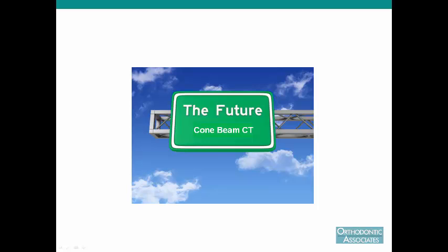So do I think cone beam CT is part of the future of orthodontics? I absolutely do. I think it renews our appreciation for the bony boundaries that our patients have, and it also really differentiates us from the GPs providing orthodontic treatment via Invisalign. Because once you treatment plan a case to stay within the bony boundaries of the arch, the treatment plans become much more sophisticated and the mechanics become more complicated.